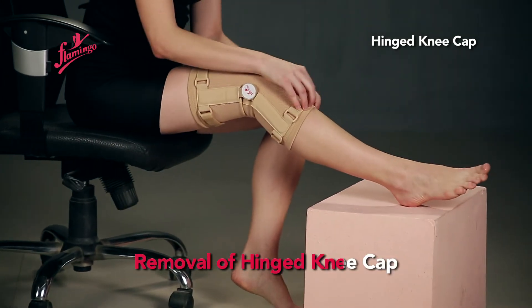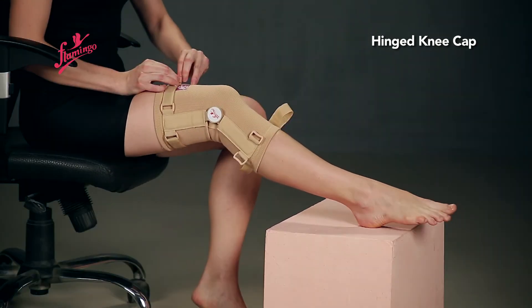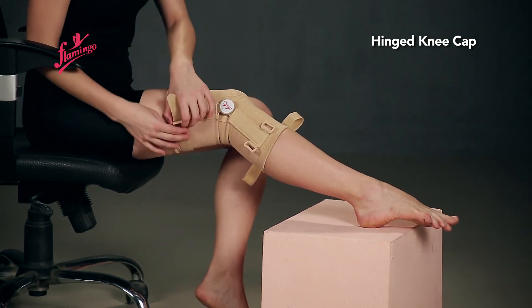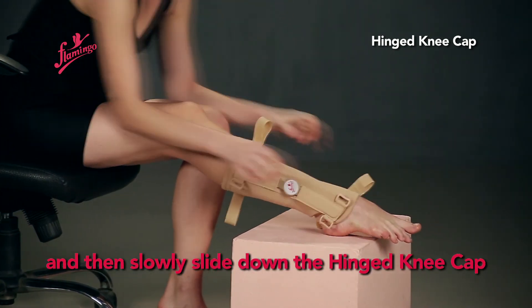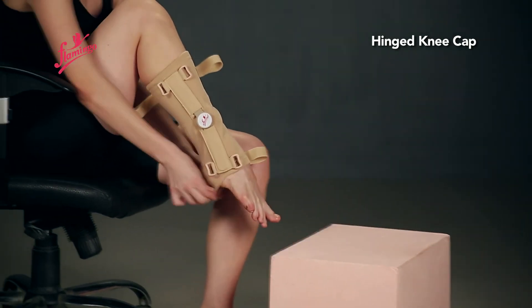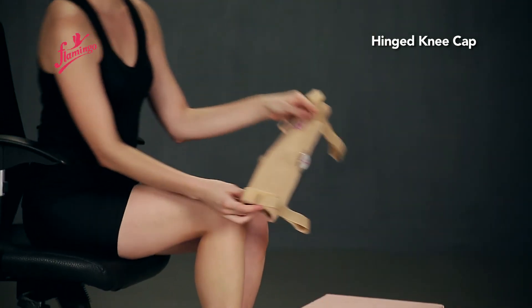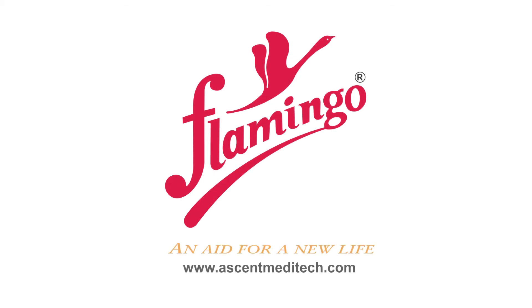To remove the hinged kneecap, begin by releasing the lower straps, followed by the upper straps, and then slowly slide down the hinged kneecap. Thank you.